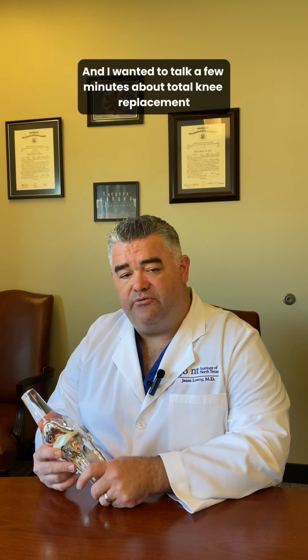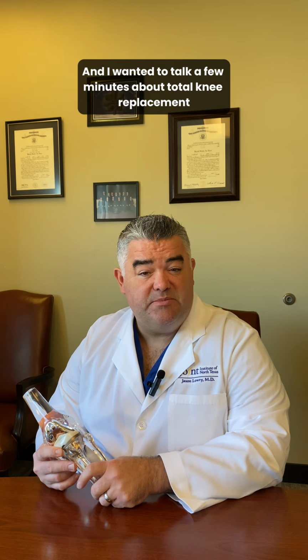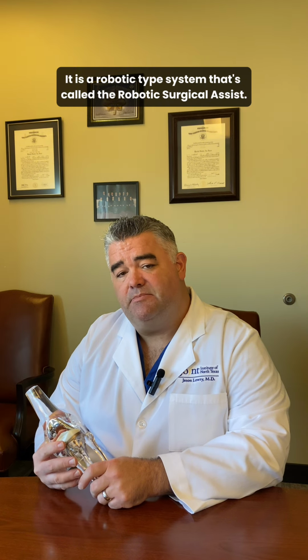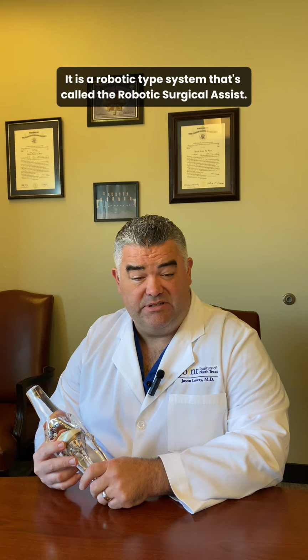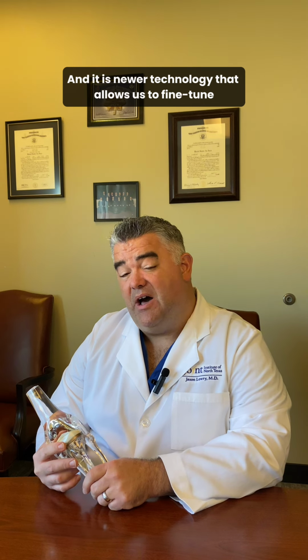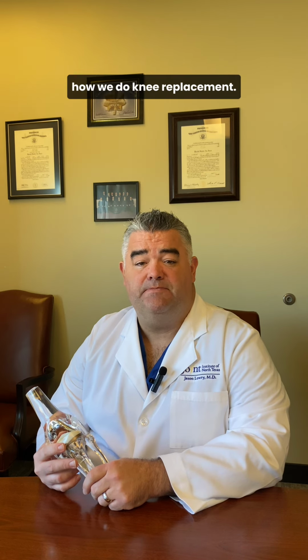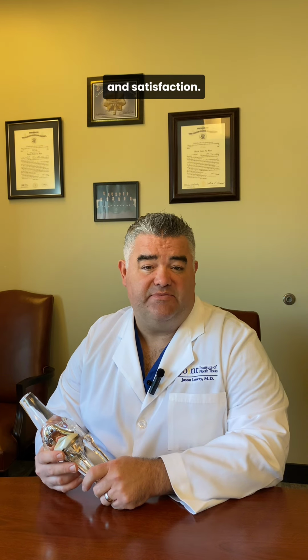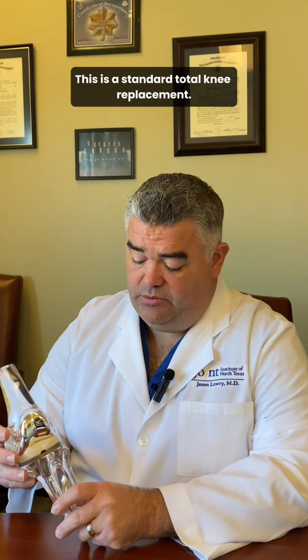And I wanted to talk a few minutes about total knee replacement utilizing new technology. It is a robotic type system that's called the Robotic Surgical Assist. And it is newer technology that allows us to fine tune how we do knee replacement with the hopes of improving patients' outcomes and satisfaction.